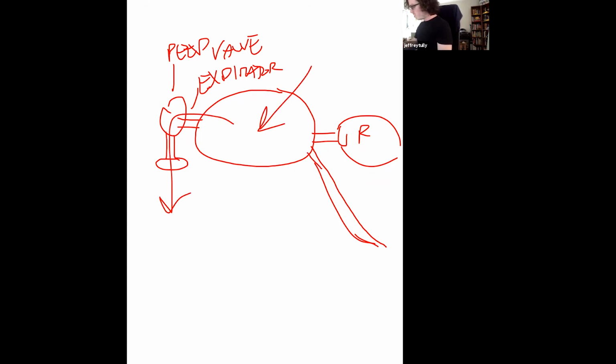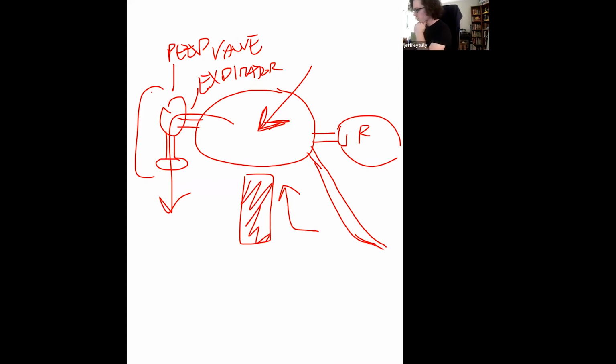Now, a lot of the solutions that have come online so far are some variant of an automated force that compresses this bag on a regular basis to essentially remove the person needing to squeeze it. In the absence of complex sensors, you don't get a sense of the pressures you're delivering, and you don't get a sense of the volumes you're delivering. But this could be the court of last appeal for a lot of patients who otherwise wouldn't get anything, and be triaged as not receiving positive pressure at all. So I'm interested in ways to upscale these types of solutions and let the big GEs of the world work on the more Cadillac ventilators.